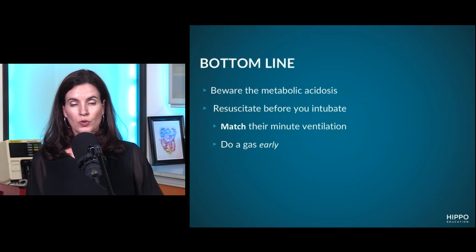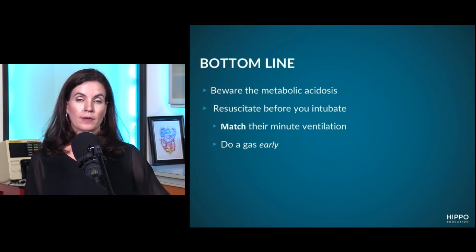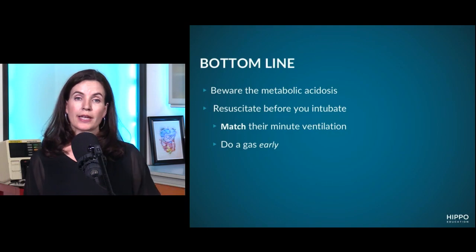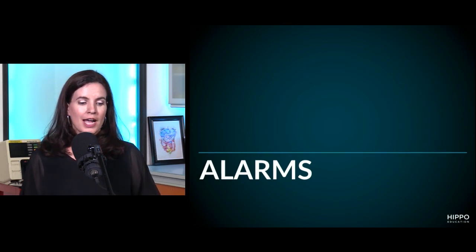But then when you do have to intubate and you're setting the ventilator, match their minute ventilation. That means match their respiratory rate and match their tidal volume, if not exceeding it by a little bit. And do a gas early to make sure you're on the right track. Okay, so those were our two special scenarios where we want to avoid those pitfalls in the emergency department.